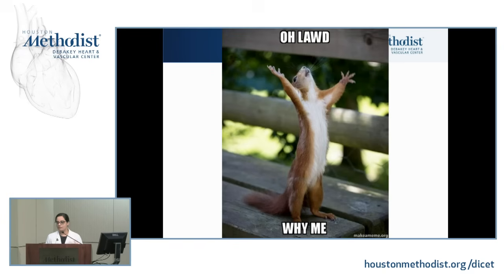So RAMP studies, oh Lord, it's the same for the sonographers and for the echocardiographers, and I'm ready to take it upon me to do this.